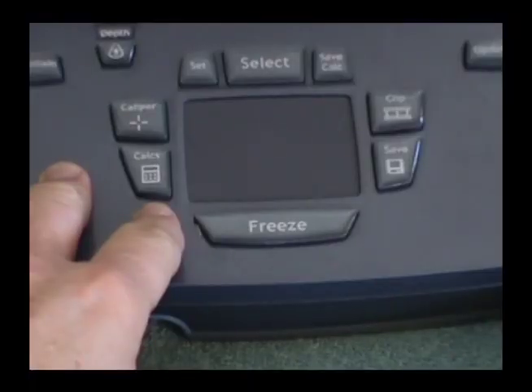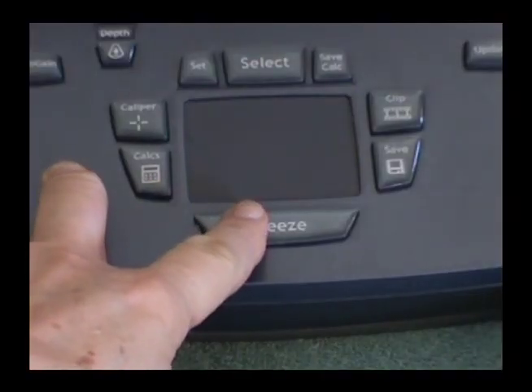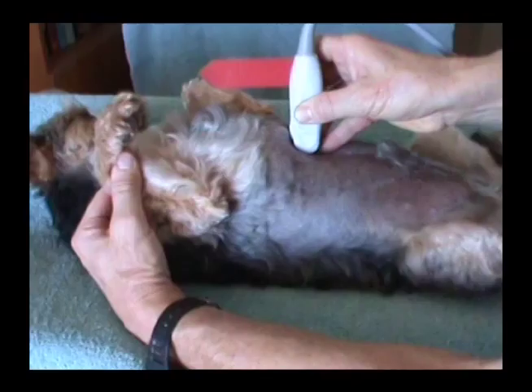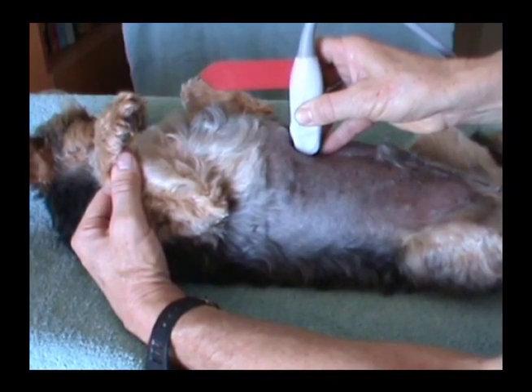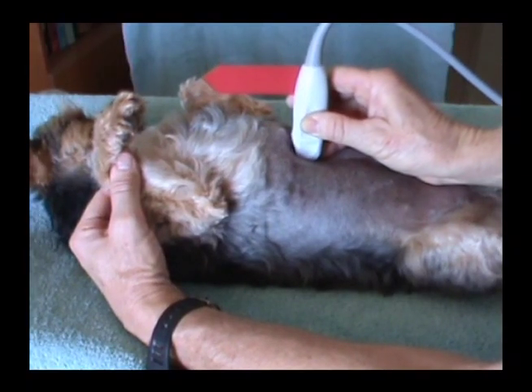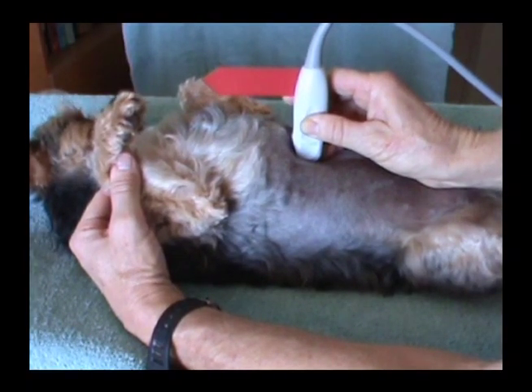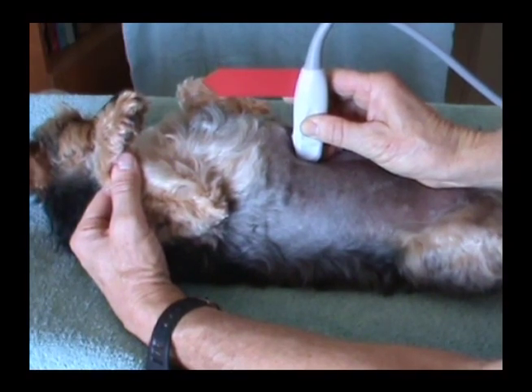Remember to keep one finger of the keyboard hand on the freeze button, ready to capture the best image. When you press the freeze button, practice leaving your transducer hand relaxed and in position so that when you unfreeze, you will still have the same image. This will save you time and effort.